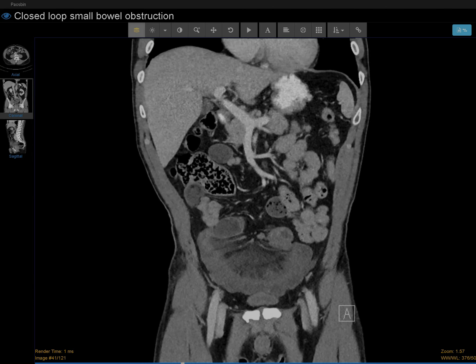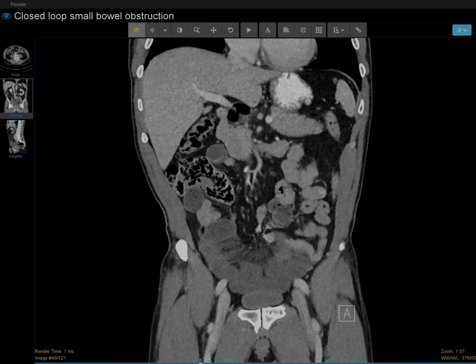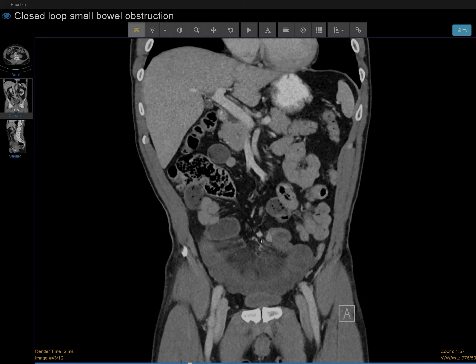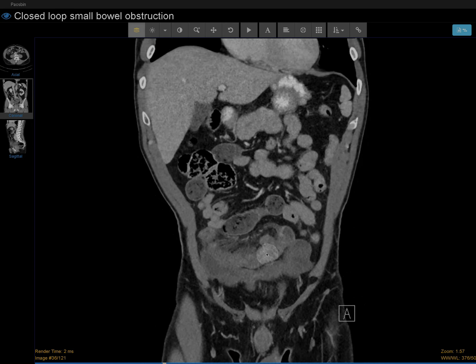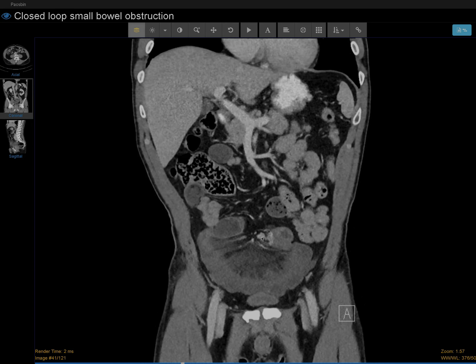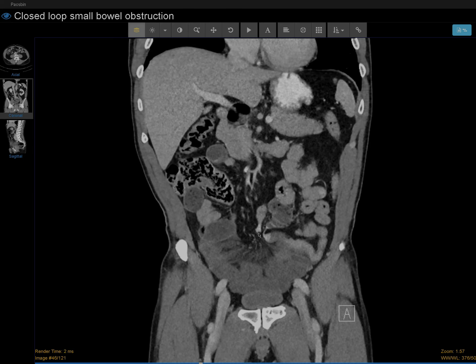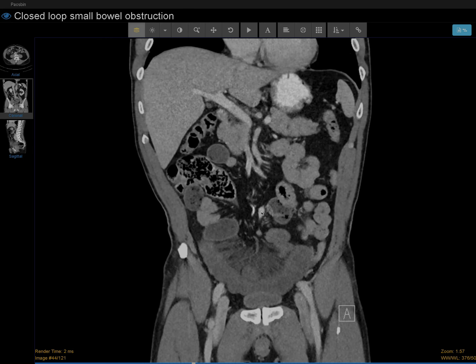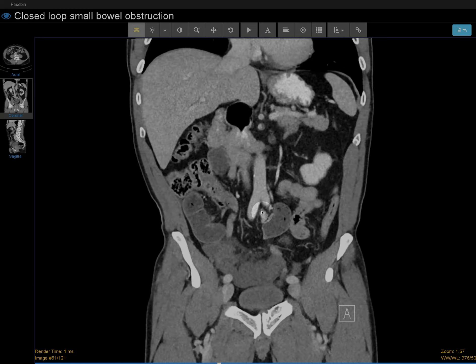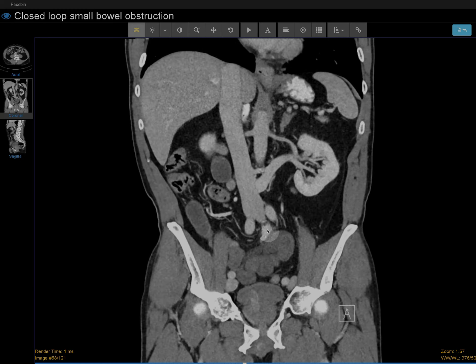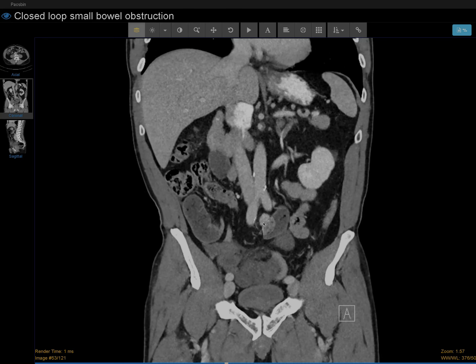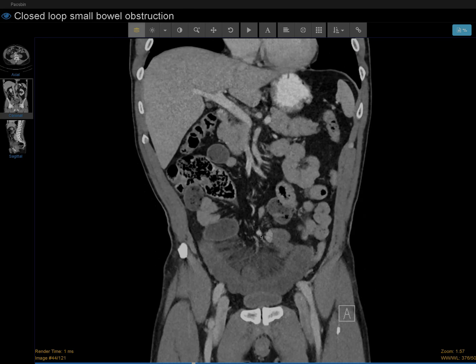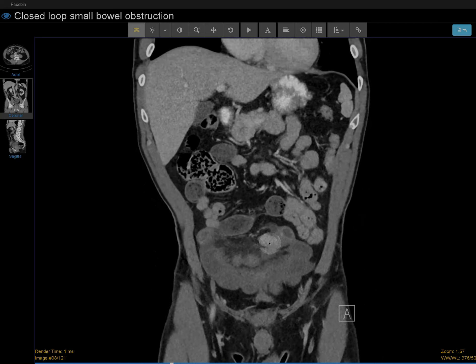Let's go back to our case. This C-shaped loop is concerning for closed loop obstruction. Let's see if we can find the birdbeaking by following this loop of bowel. Right here I find a point where the loop of bowel narrows — birdbeaks — and here the bowel is now enhancing normally. After this birdbeaking, it's abnormal.